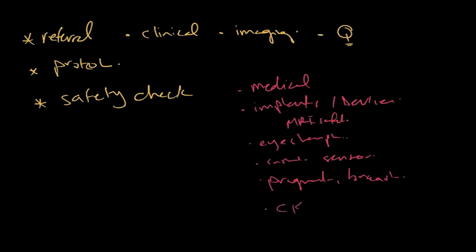You need to know if your patient has any chronic kidney disease, obviously because of the risk of nephrogenic systemic fibrosis in patients on dialysis and advanced kidney disease. Obviously, you need to know what commercial type of gadolinium you use in your center. You need to know about any allergy, especially any allergy to a gadolinium-based contrast. And you need to know if your patient is claustrophobic.